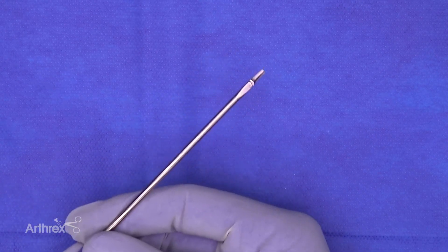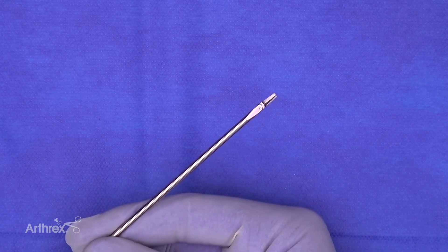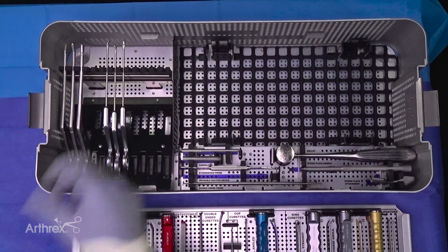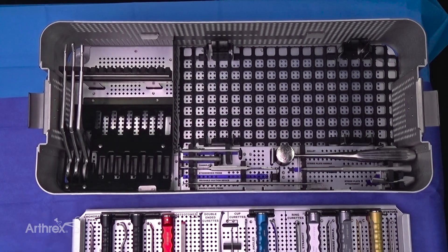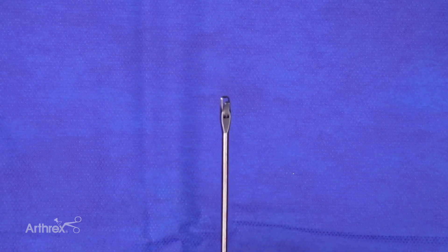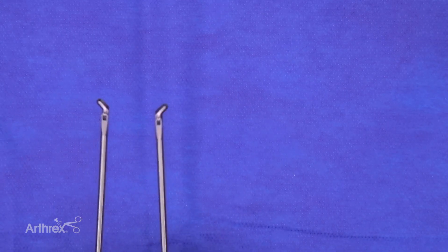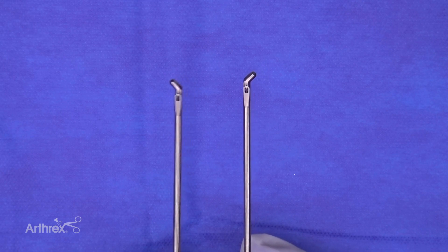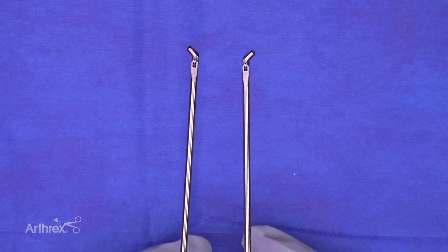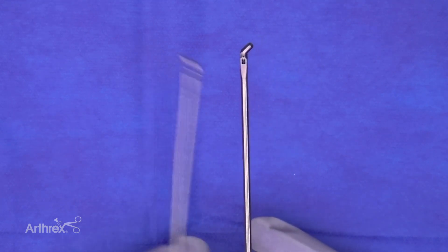We have an arthroscopic scissor — a shorter-length standard arthroscopy scissor. For standard instrumentation we also have various punches of different diameters: a small punch, a large straight basket punch for bigger bites, and curved left and right punches so the surgeon can more easily reach posterior-medial or posterior-lateral and bite whatever they need to remove.